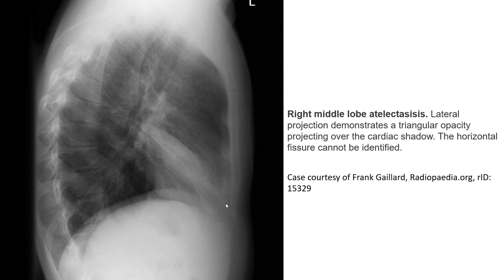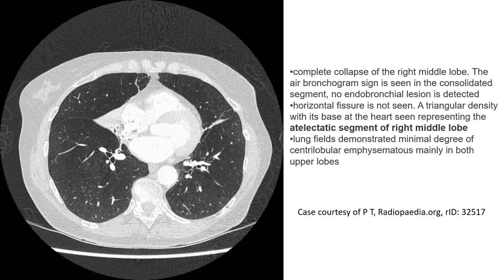A triangular opacity projecting over the cardiac shadow — the horizontal fissure here cannot be identified. This finding should represent right middle lobe atelectasis. CT confirmed complete collapse of the right middle lobe. The air bronchogram sign is seen in the consolidated segment. No endobronchial lesion is detected and the horizontal fissure is not seen.